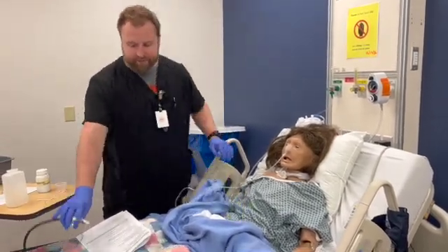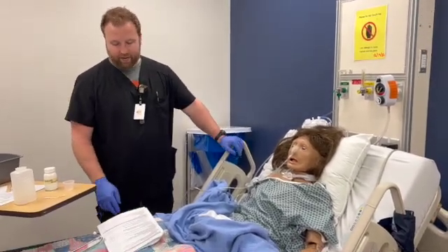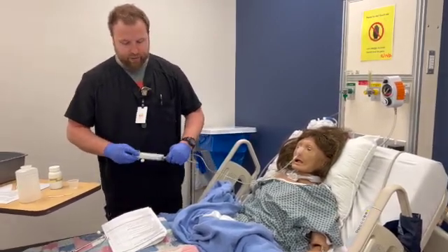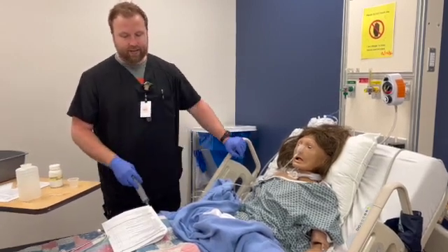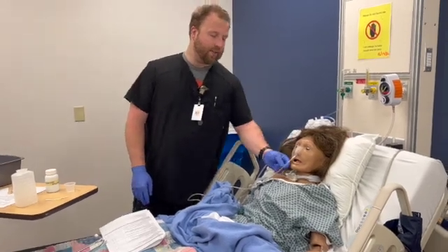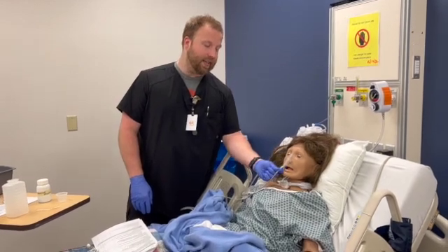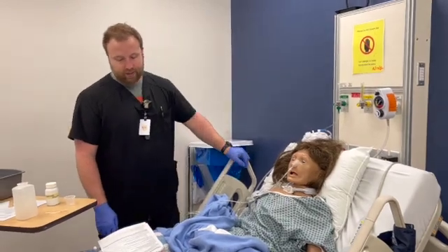I'm going to feel. I want to verify your tube placement. Once again, pretty much anytime you do anything with this, we'll verify your tube placement. Pull them back a little bit, put that in there. It is fine. Ensures patency of the tube. We want to make sure there are no cracks, no leaking. I also want to make sure that it's at the same point where I inserted it. If I see it hanging out, it's obviously not going to be as patent as it was.